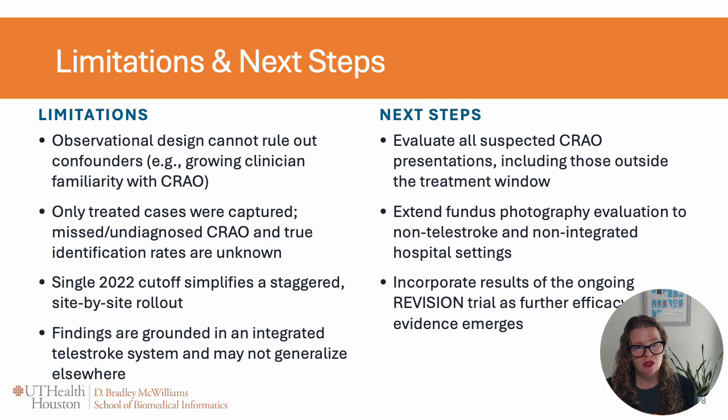Our next steps are to evaluate all suspected CRAO presentations, see how fundus photography evaluation could be implemented in a non-integrated hospital setting, and review the outcome of the revision trial, which is that randomized control trial to see whether or not IV thrombolytics are a good or not a good response for central retinal artery occlusions.